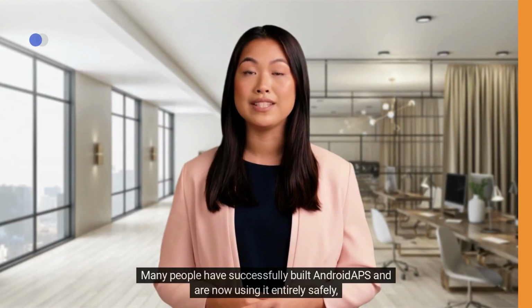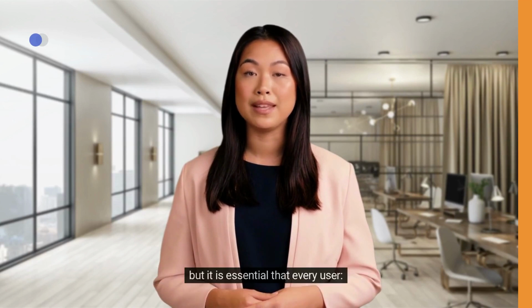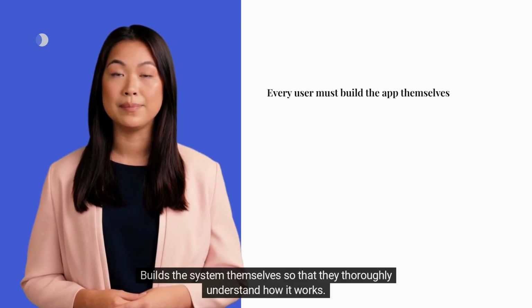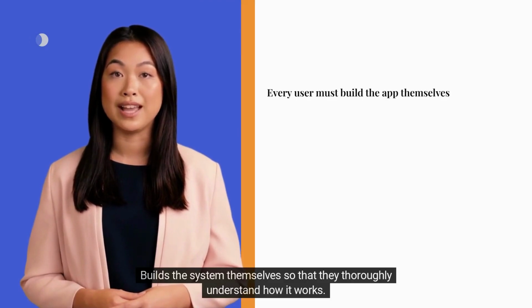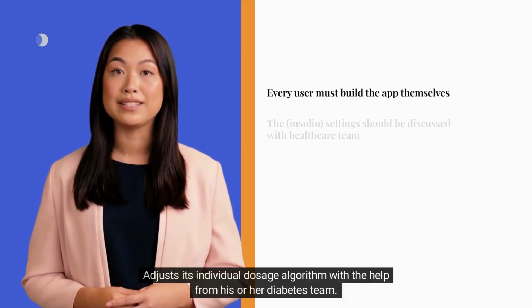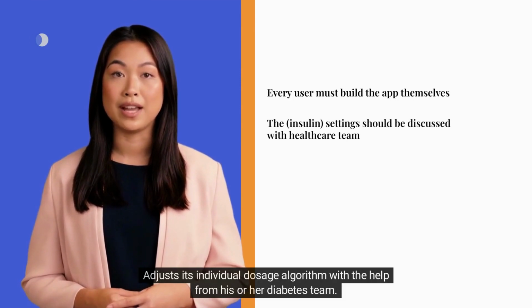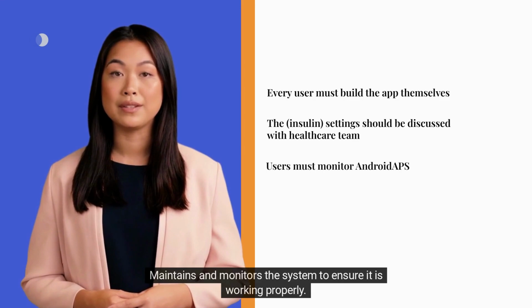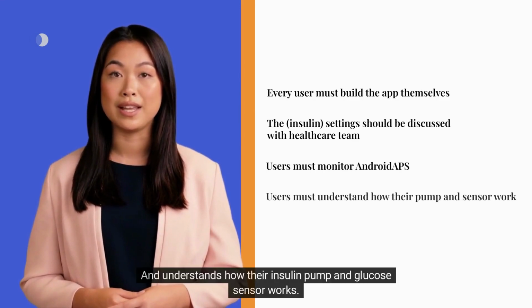Many people have successfully built AndroidAPS and are now using it entirely safely, but it is essential that every user builds the system themselves so that they thoroughly understand how it works, adjusts its individual dosage algorithm with the help from his or her diabetes team, maintains and monitors the system to ensure it is working properly, and understands how their insulin pump and glucose sensor works.